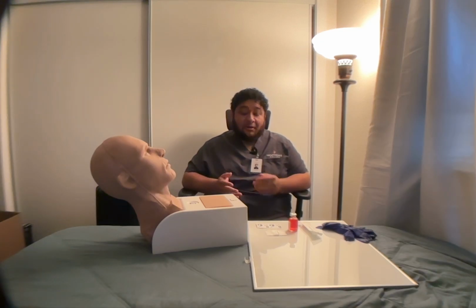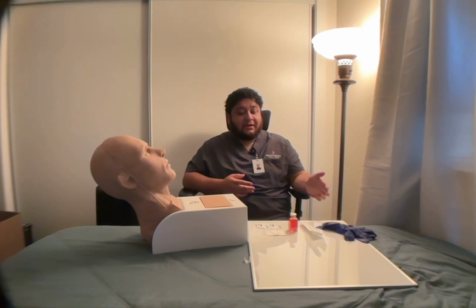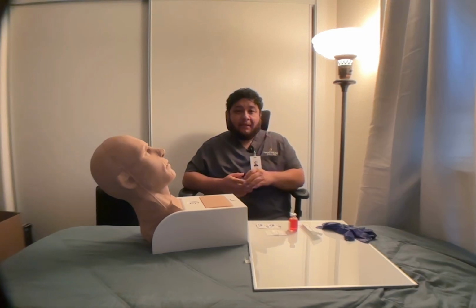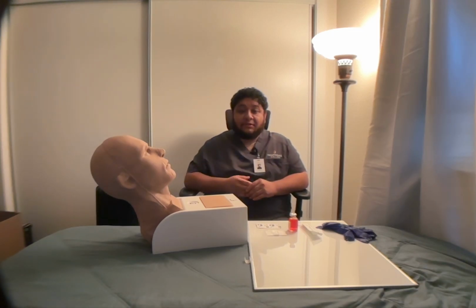So, the supplies. This is my badge, and the supplies that I have with me are a set of clean gloves, syringe, medication vial, alcohol swabs, and gauze, and a sharps container to dispose of my syringe after use.